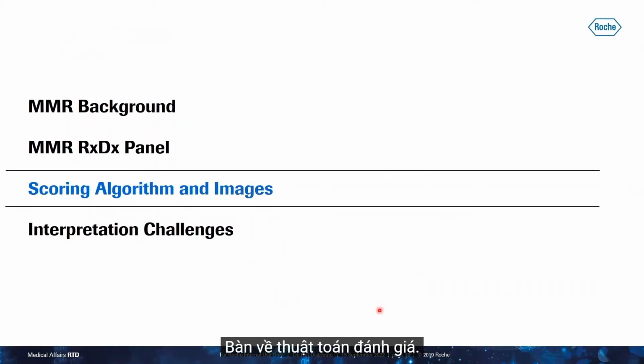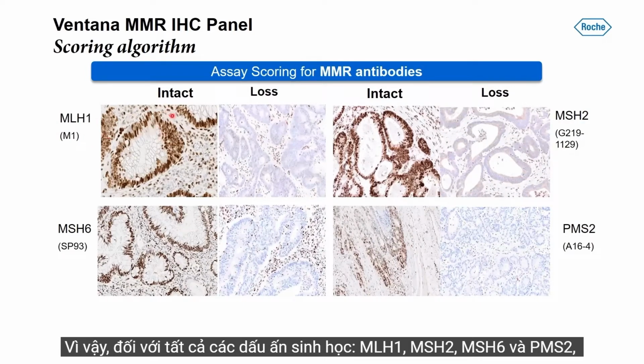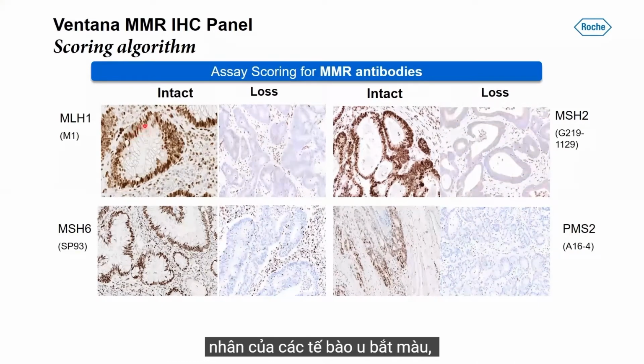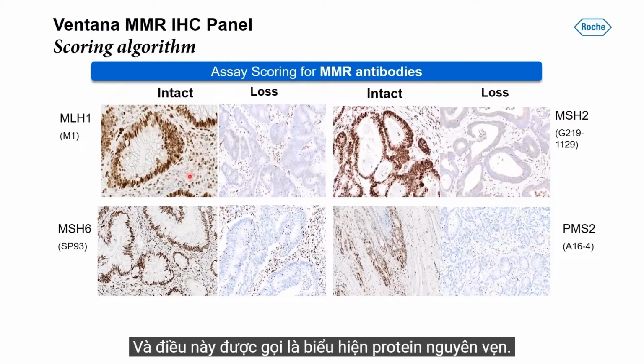Let's talk about the scoring algorithm. So this assay is scored as either intact protein expression or loss of protein expression. So for all biomarkers, MLH1, MSH2, MSH6, and PMS2, there should be a demonstration of nuclear expression by the tumor cells to be compared with the internal control positive cells, which are the stromal nuclei also exhibiting acceptable staining. And this would be called intact protein expression.